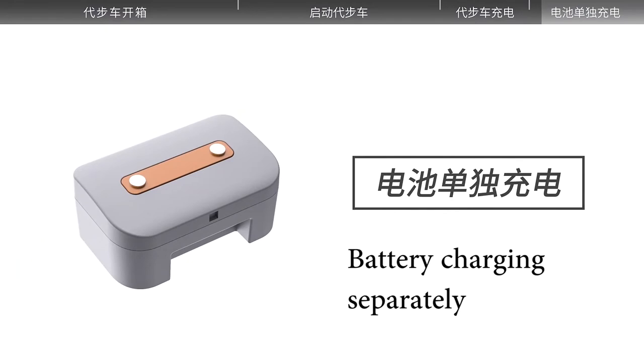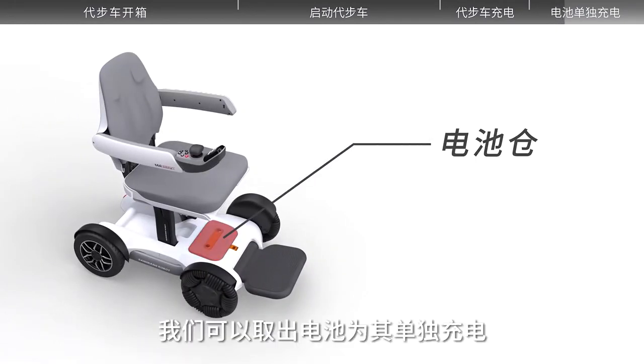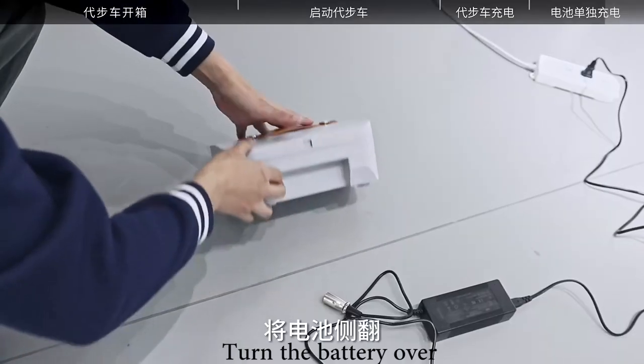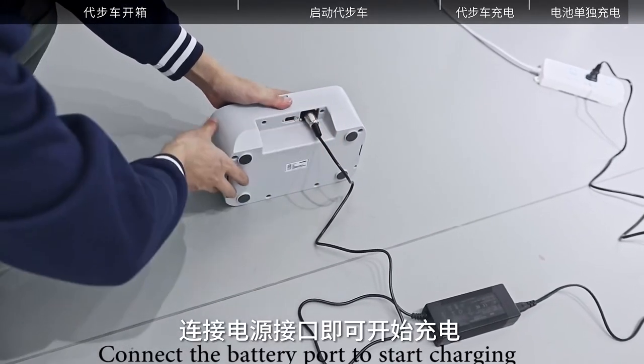The battery is able to be charged separately. The scooter battery is located under the seat. Move the battery and charge it separately. Unlatch and remove the battery. Turn the battery over. Connect the battery port to start charging.